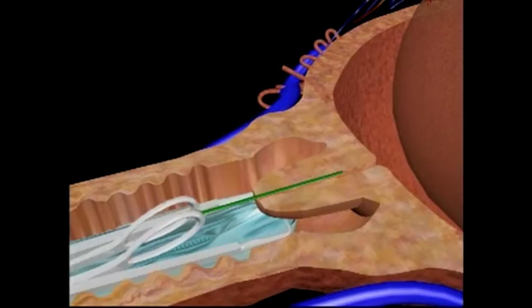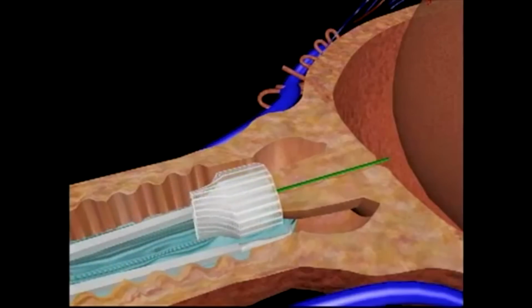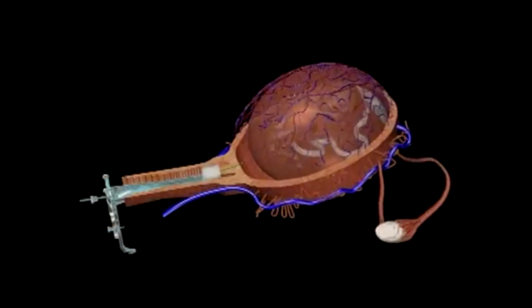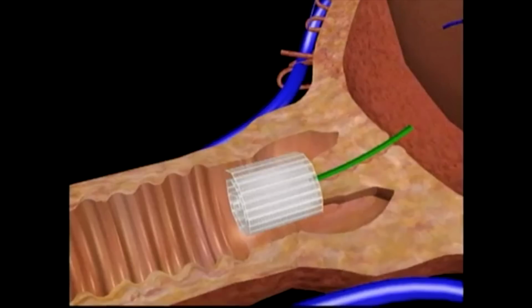Once that's done, forceps are used to insert the laminaria and place gauze over the mouth of the cervix. The tenaculum is then released, and the speculum is removed. As the laminaria absorbs moisture from the cervix, it expands and dilates the cervical opening. This process generally takes several hours to complete, but in the case of very late-term procedures, it can take 2 or 3 days. In some instances, subsequent laminaria installations are required in order to achieve the necessary dilation.